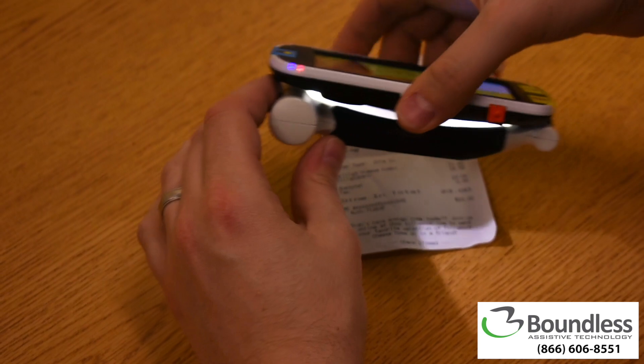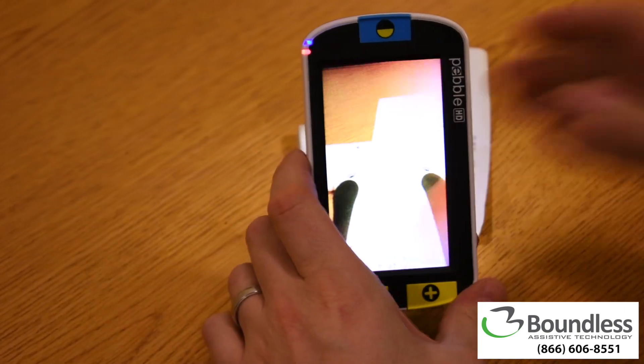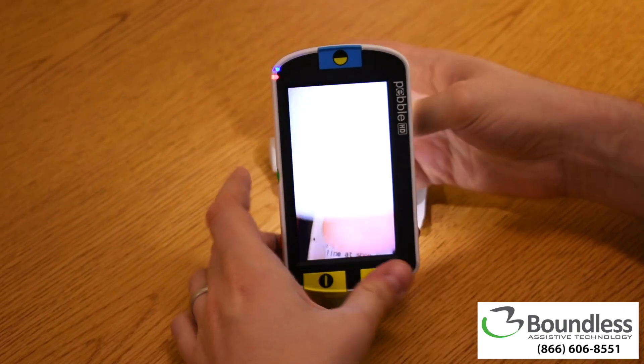Alternatively, the device can be set up on its rest for viewing items that you need to hold still with both hands, like a pill bottle.